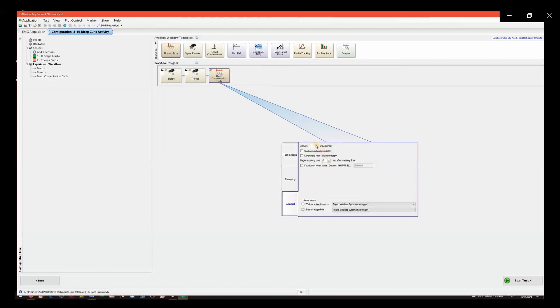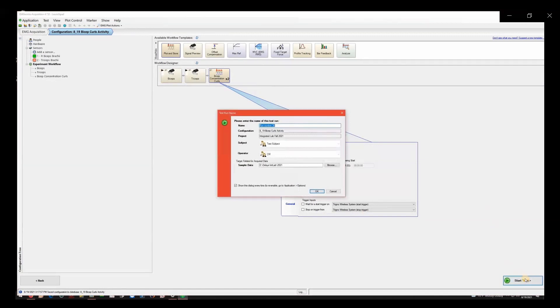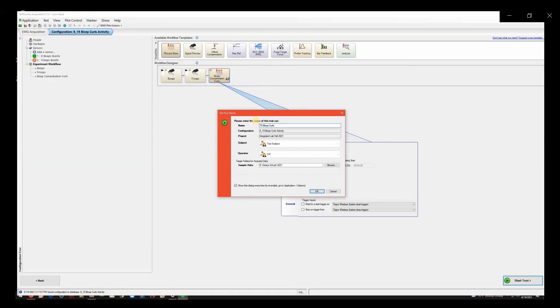Once the experiment workflow is completed, click on Start Test in the bottom right-hand corner. Rename this Test Run using the Subject Initials, Name of Activity, and Test Run Number. Make sure the correct subject and operator are selected. Make sure the correct target folder is selected. Locate the data folder for your class. Click OK. Now click OK on the Test Run Name dialog box.